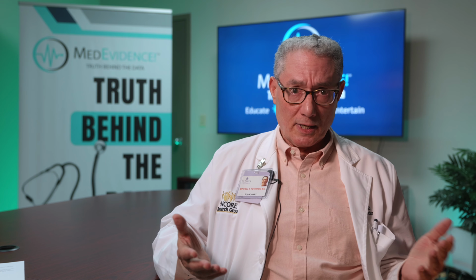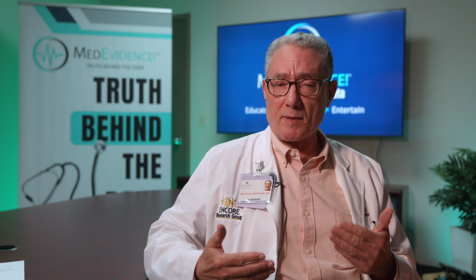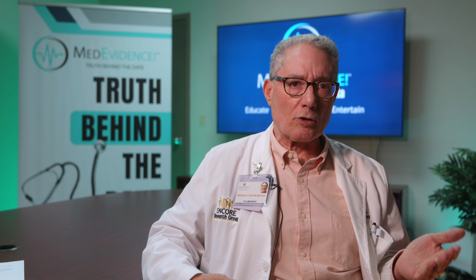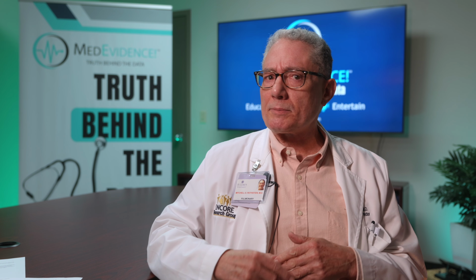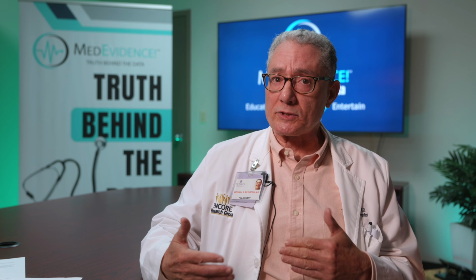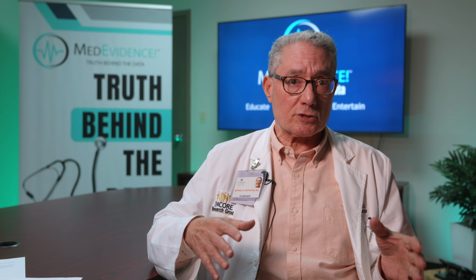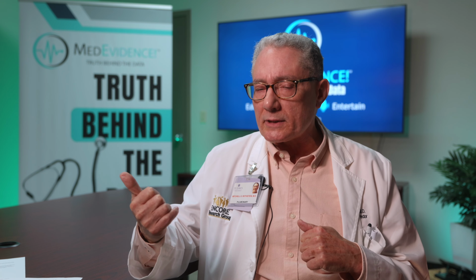We also know that people with MASH, metabolic associated steatohepatitis, have a host of other medical problems. They die more quickly from cardiovascular disease. Among people with diabetes, 70 to 80% will also have problems with their liver. So this is a common problem, and we need to get our hands around it so we can follow and treat these patients. Let's go over and see what the actual procedure of a FibroScan looks like in real life, and then we'll come back and talk about how we use that information.